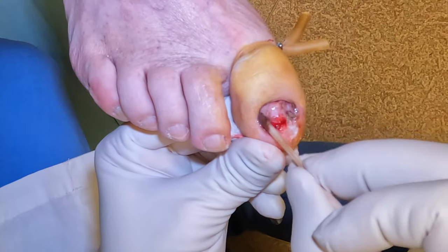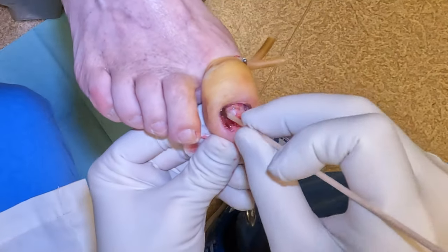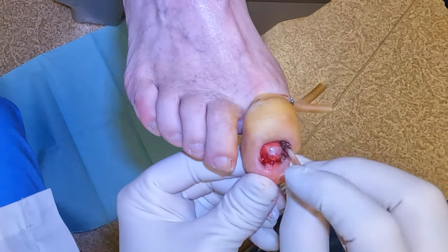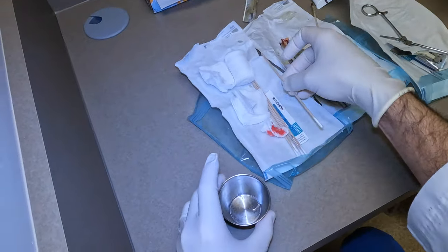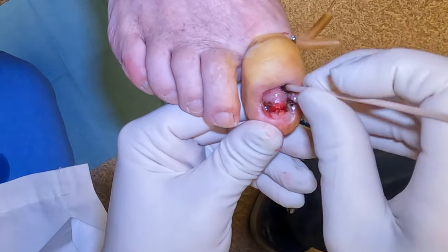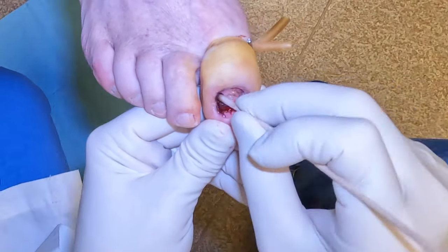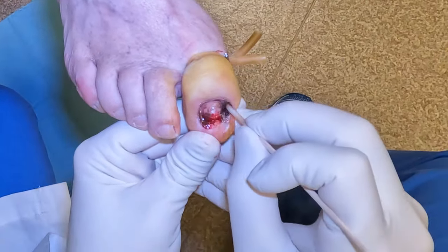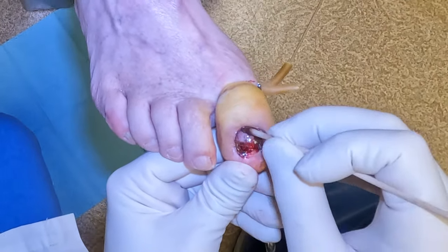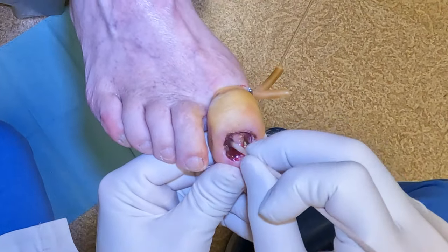We'll do three applications of this. If you've seen some of my previous videos, you'll see us doing this even when we're doing a partial nail removal — just a matrixectomy of the borders — putting this into the corner to stop the nail plate from growing back. The typical application is three 30-second applications or three one-minute applications. The idea is to burn or chemically destruct those cells that grow the toenail.